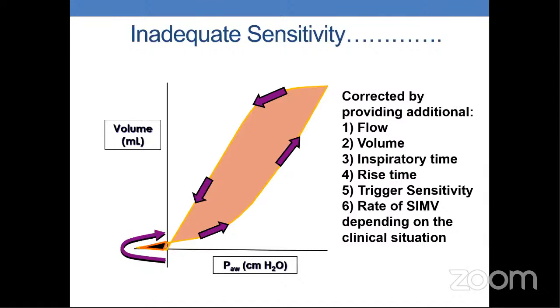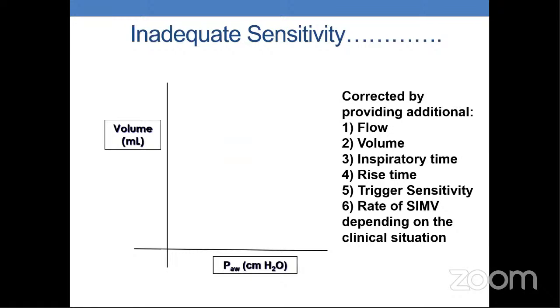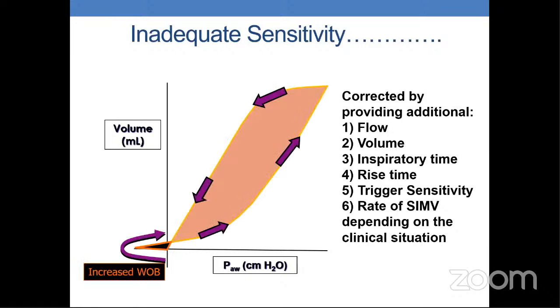Your parameters may be okay and you need sedation to prevent the baby from breathing, for example in a surgical patient you don't want to extubate, or you might only have to extubate. You don't need to sedate or increase the rate, you just maybe need to come off the ventilator.